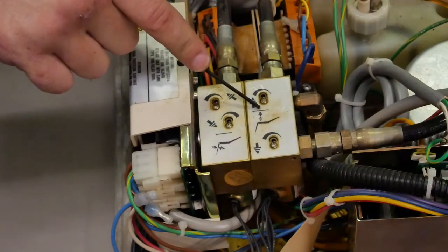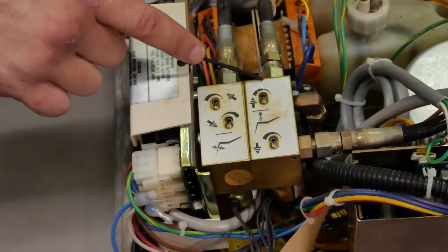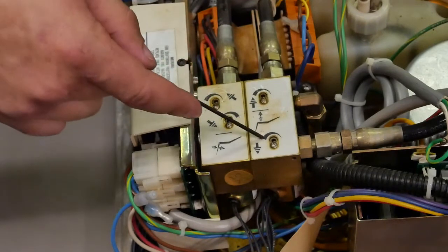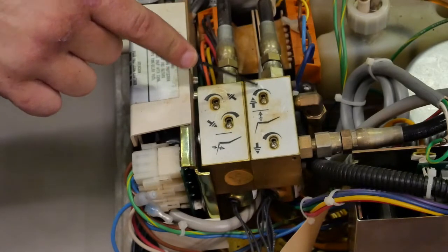And on this side, we have the base up and down. And this one, it's both the same. So for both of these, you go counterclockwise to go faster and clockwise to go slower.